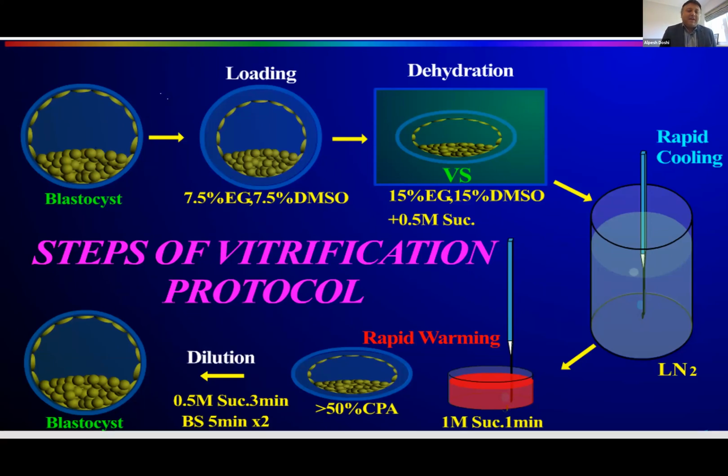This is just a brief schematic around blastocyst vitrification. And again, this specific slide is talking about the protocol using the Kitazato vitrification kit. The first solution, the ES or equilibration solution, has typically 7.5% ethylene glycol and 7.5% DMSO. Then you move onto the vitrification solution, which has 15% ethylene glycol and 15% DMSO plus sucrose. And then once you have taken the embryos or blastocysts through these two solutions, you literally load it on your carrier and vitrify it in liquid nitrogen.